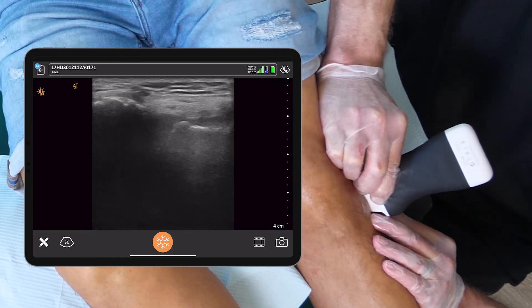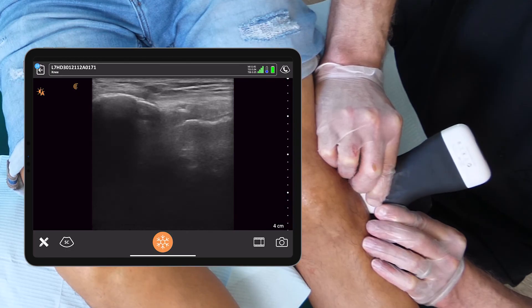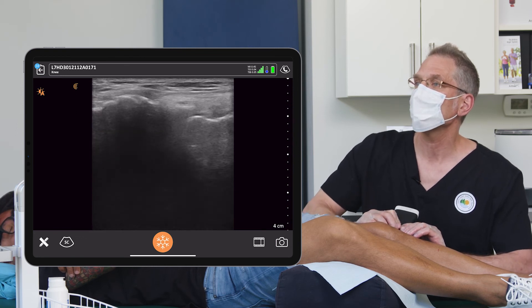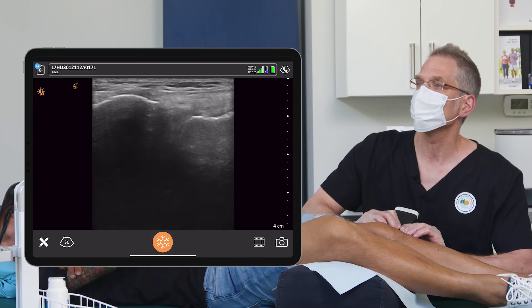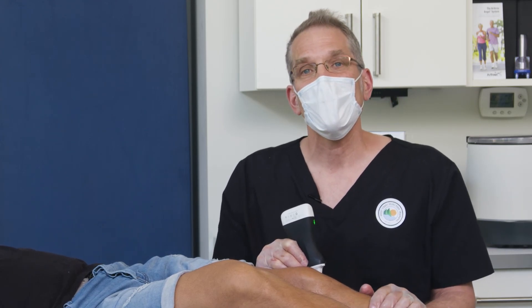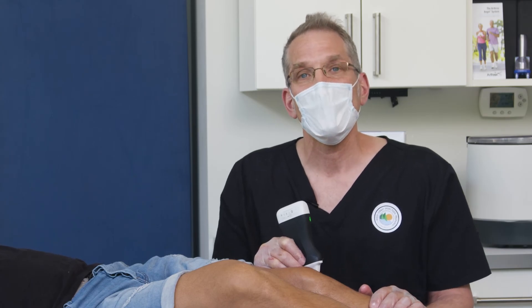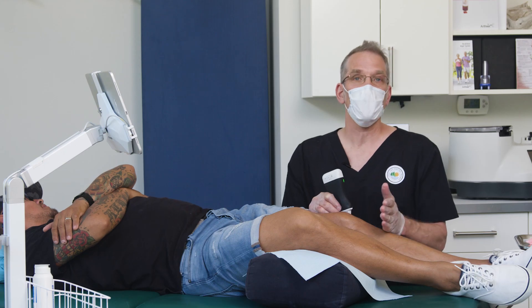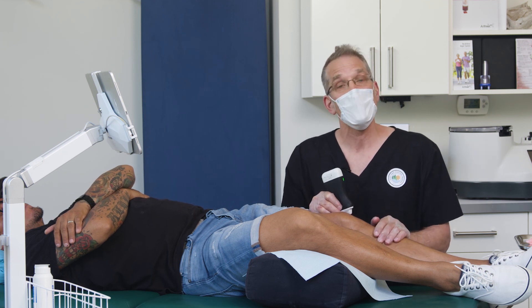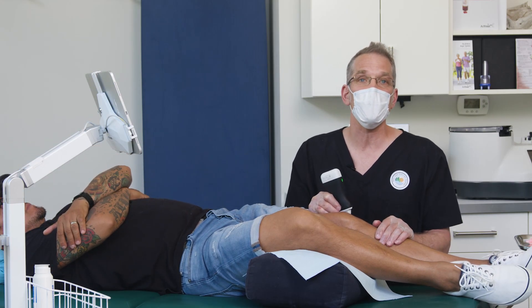The lateral joint line is right here. One can look at the lateral meniscus, though there's much less to learn about it on a knee exam than there is on the medial surface. In conclusion, Rico's knee has no fluid that needs to be aspirated. The tendons and ligaments look healthy. There is a little bit of lipping calcification forming on the medial surface of the knee. This illustrates the limitation of sonography on a joint — sometimes it can be exceptionally helpful, sometimes not helpful at all. In Rico's case, he's having pain everywhere, and the only pathology I'm seeing is a little bit of calcification on the medial joint line.